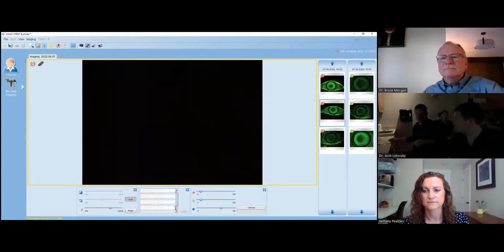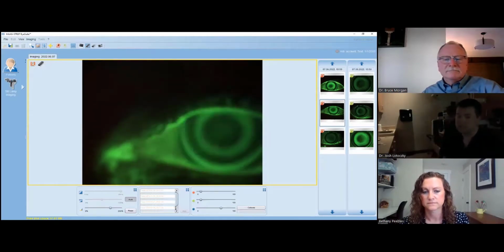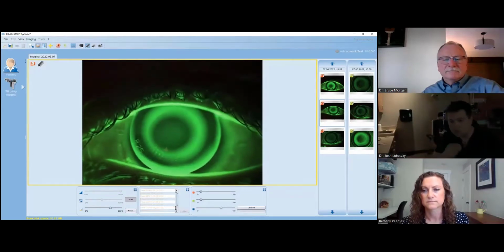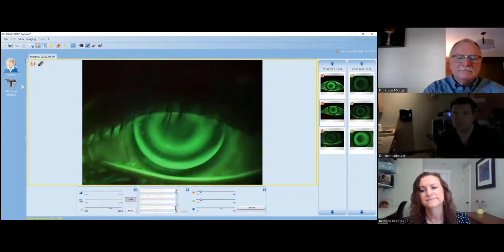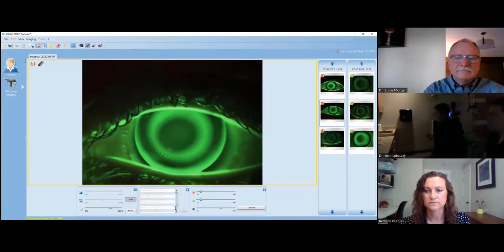Yeah, we use them multiple times on the same eye. Once we put it on to begin with, we just set it back on the wrapper and you can keep using it. There's a lot more fluorescein in those little strips than what you need, which is why anybody can just paint it right on.